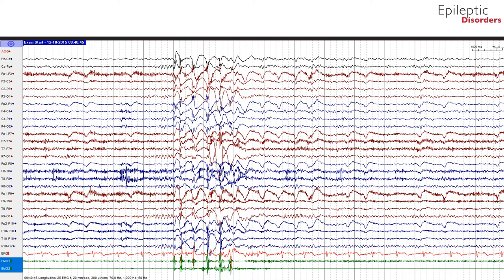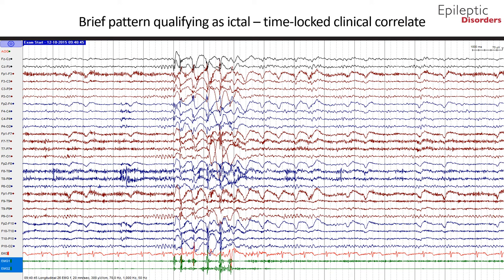The first type of seizure we will talk about is a brief pattern qualifying as ictal with time-locked clinical correlate. In this bipolar montage EEG, shown is a brief pattern qualifying as ictal that is time-locked with clinical manifestations.